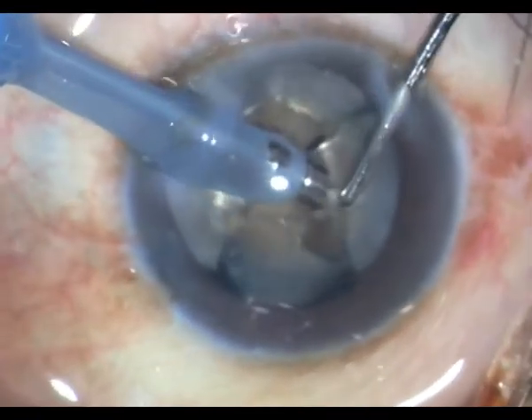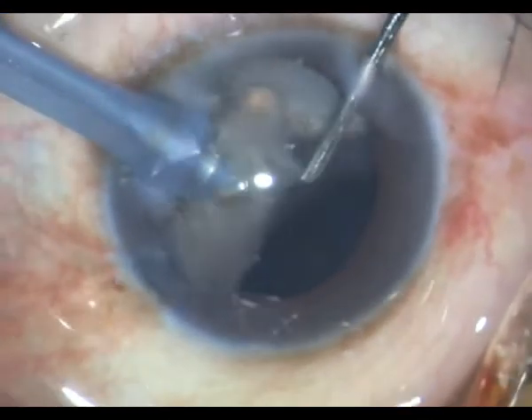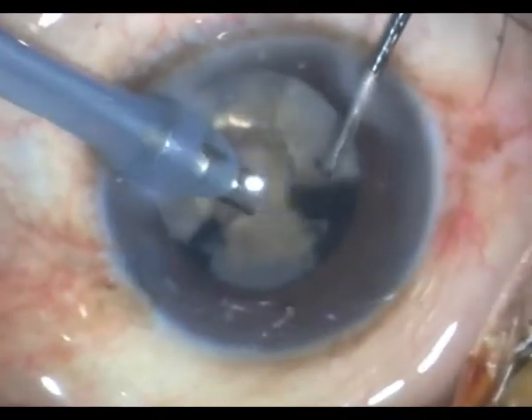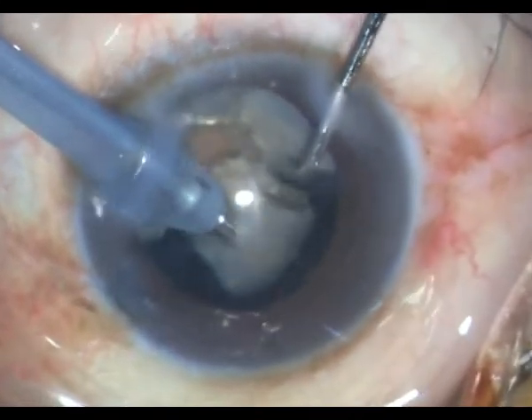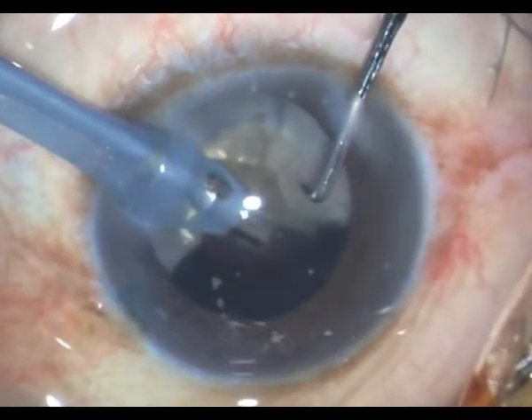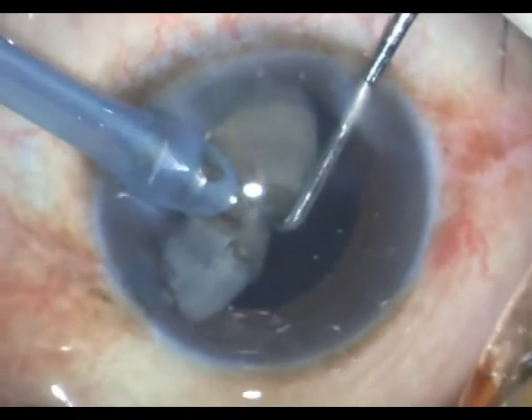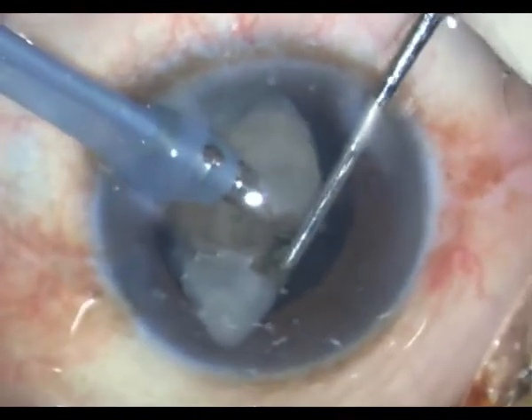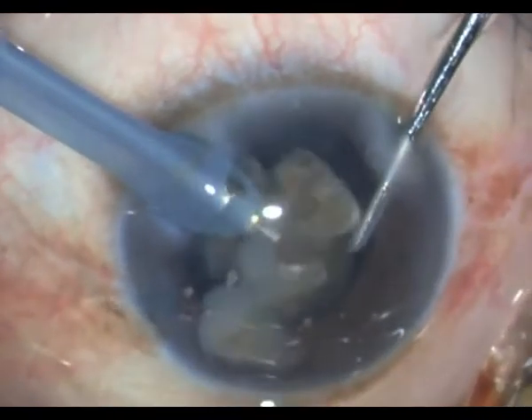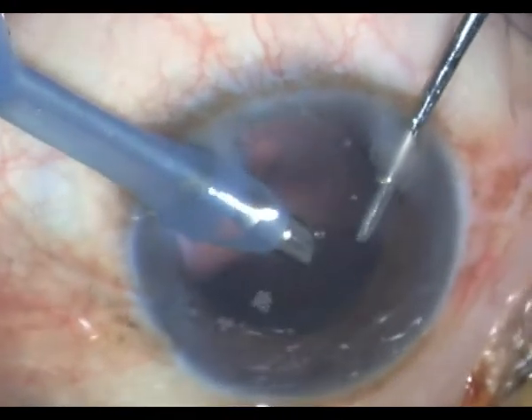Observe how easy it is to stabilize this highly mobile hard nucleus with this technique. Once done it's very easy to emulsify all these fragments. I am still at continuous power and I don't change any of the parameters. I could substitute the sharp chopper with the blunt Sinskey but I haven't done that, and you can see how stable the chamber is — there is no surge whatsoever.